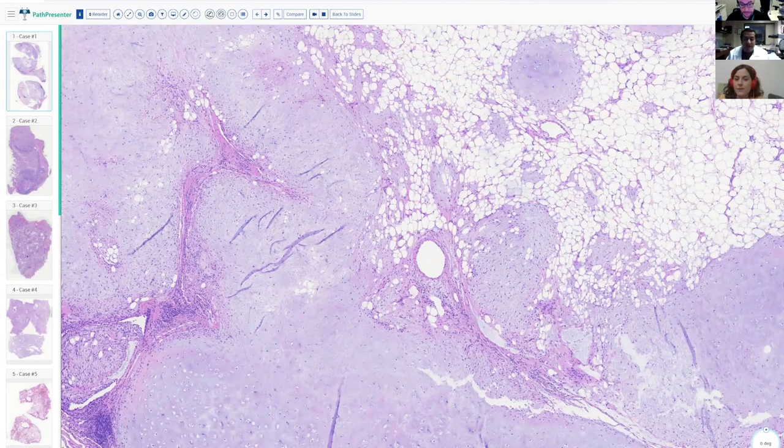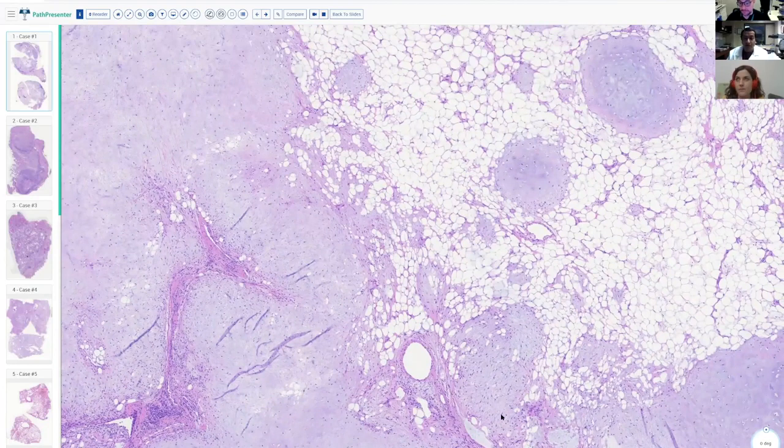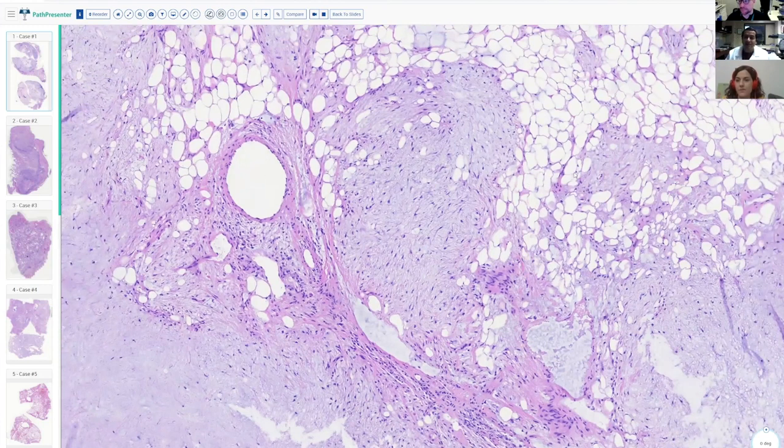Actually, if I have that, that's one setting in which you suspect a metastasis: a spindle cell lesion with entrapped epithelium and nothing else. But I have had cartilage-poor cases, with no cartilage, only myxoid stroma and fat. That's the case I presented at the evening session at USCAP.